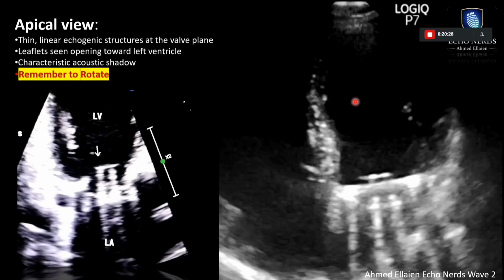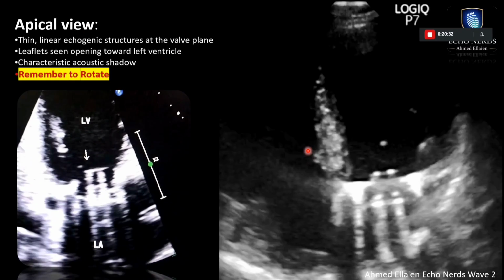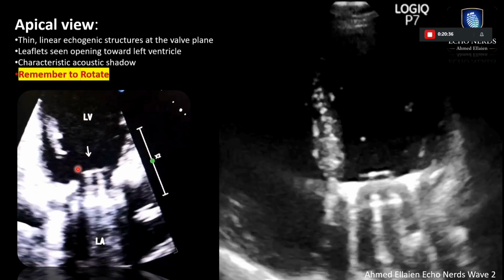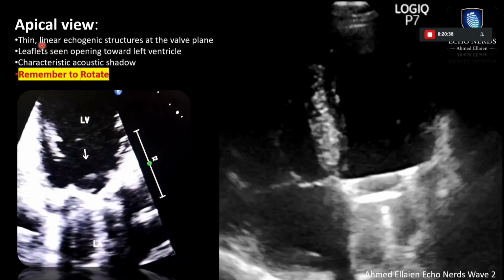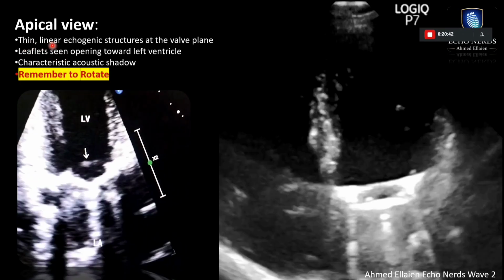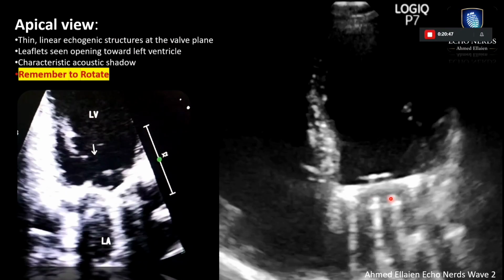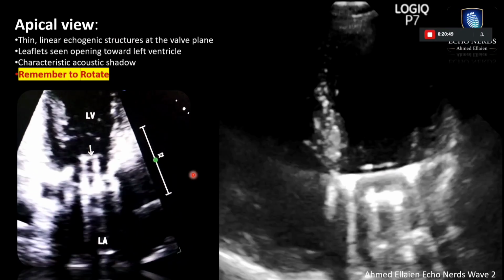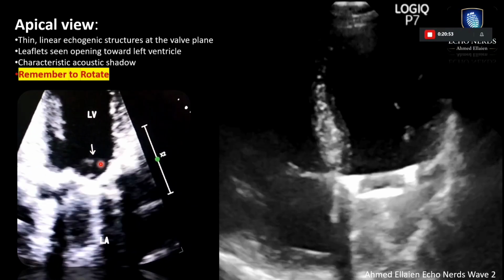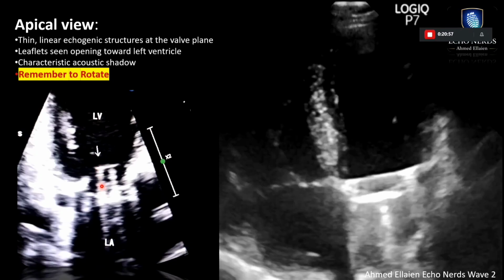Let's see the shape of the valve in echocardiography. Those are apical views, apical 4-chamber view and the apical 2-chamber view. We can appreciate the shape of the bileaflet mechanical valve: thin linear echogenic structures at the valve plane. Those are the two discs opening and closing here and here, making two very bright, echo bright lines.